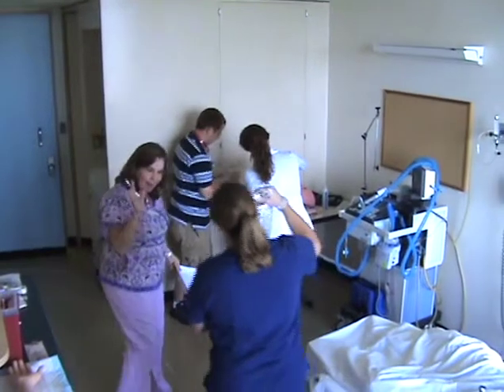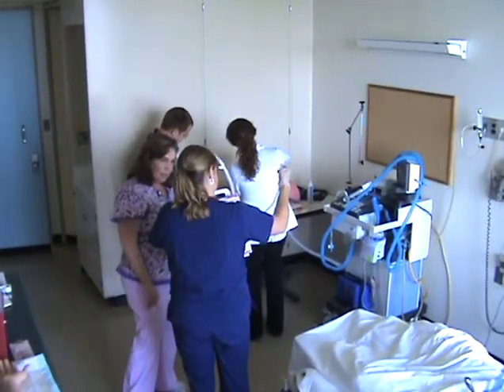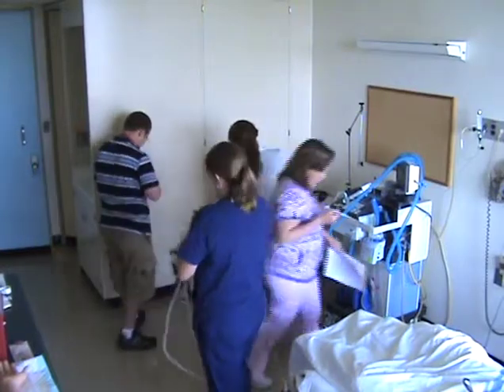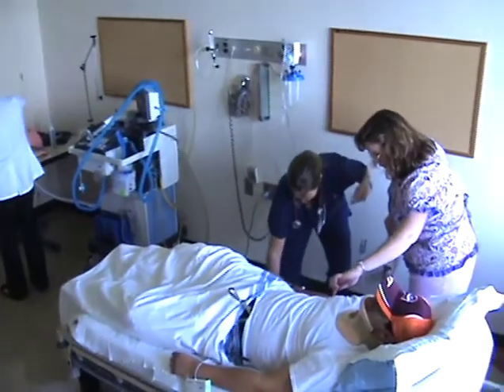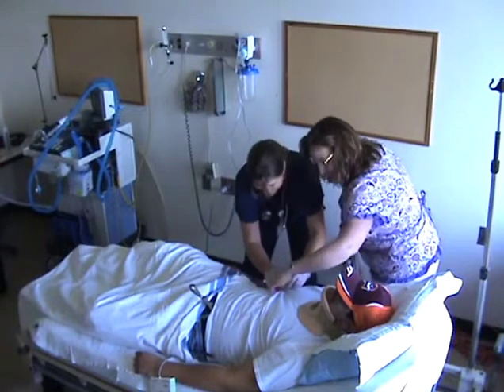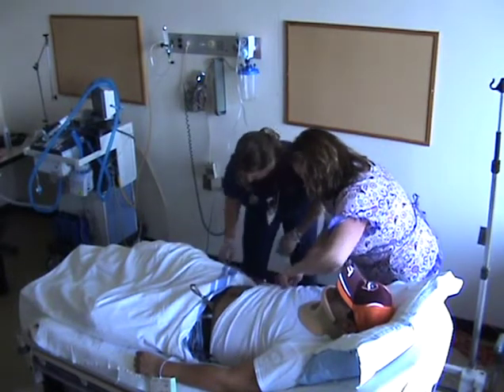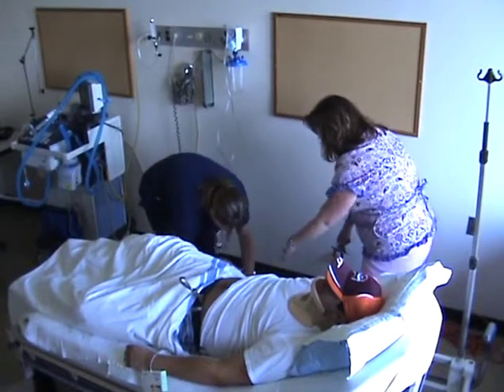So we're going to pretend like we're putting it in where we put the needle in. The chest, yeah, that goes to him, so we're going to go on the right side here. It's here, but we inserted it. We're just going to pretend it's correct. Get up under it. Can we put a chest tube in? Okay, all right, so we got the chest tube. Okay, we're not going to worry about that.